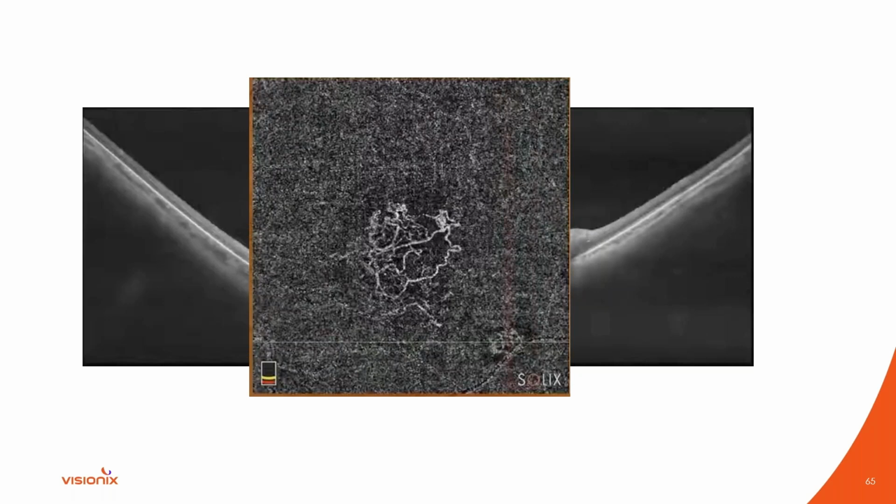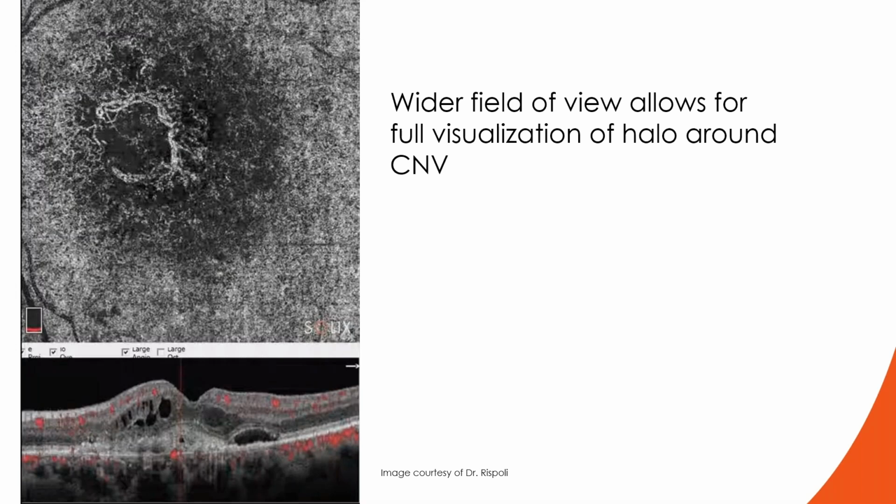So this is the flow that I do in clinic, right? I'll start off with the B scan, I'll assess it. If there's something that I want to look at in more detail, or if I'm trying to evaluate further, I'll go ahead and get OCT-Angiography. And this is just a brilliant capture of a patient that had a choroidal neovascular membrane from pathological myopia.